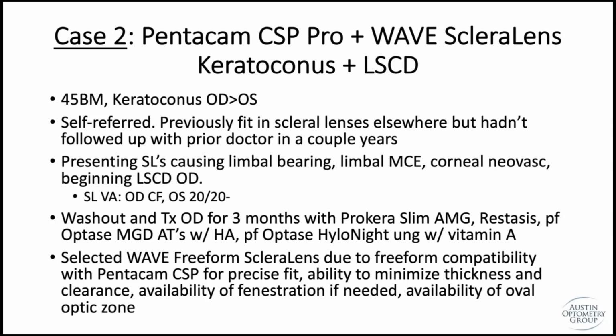Just do another keratoconus case, but from the CSP Pro. So this is a 45-year-old black male. Again, right eye worse than the left eye. He was already in scleral lenses.